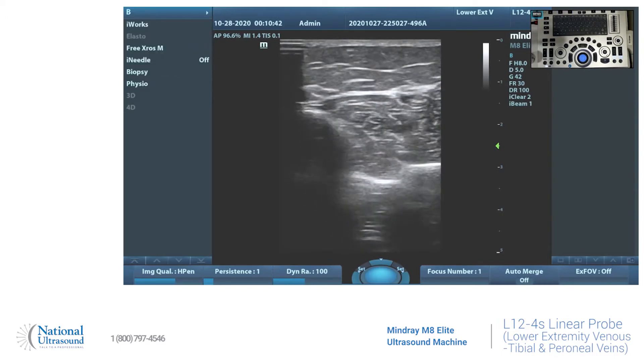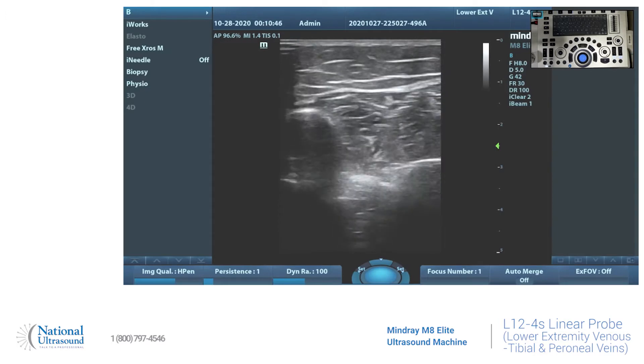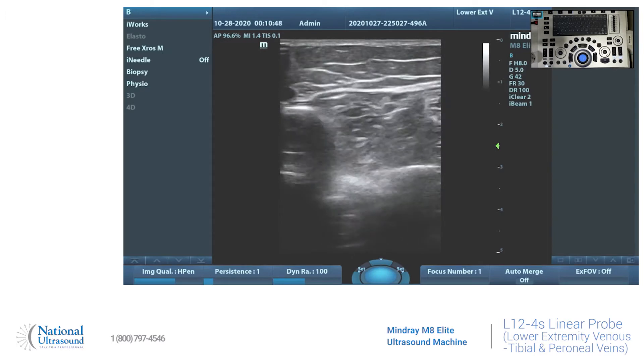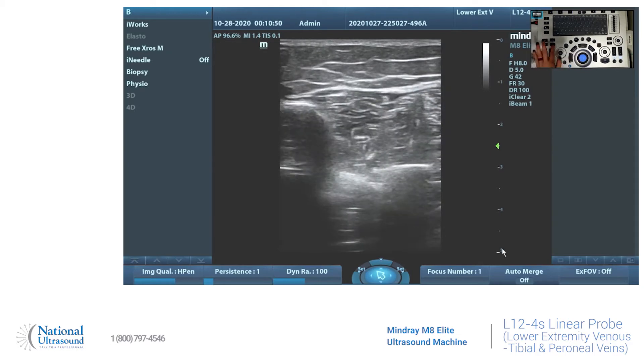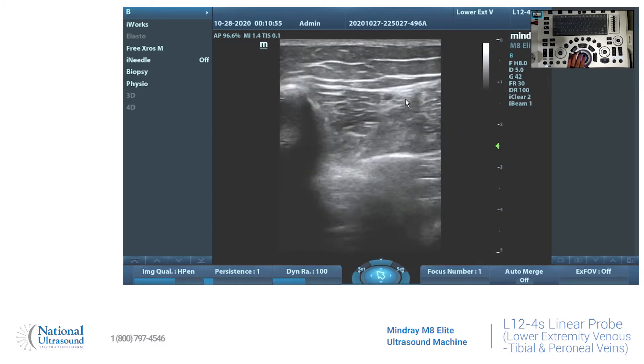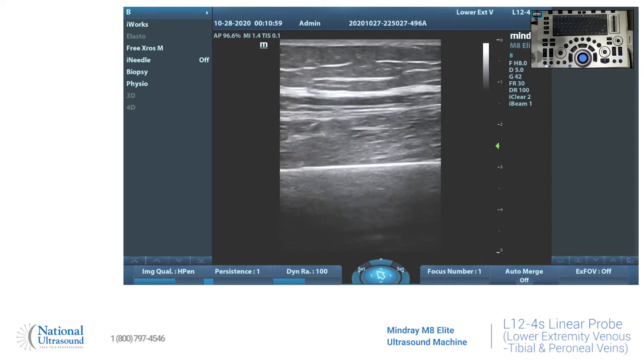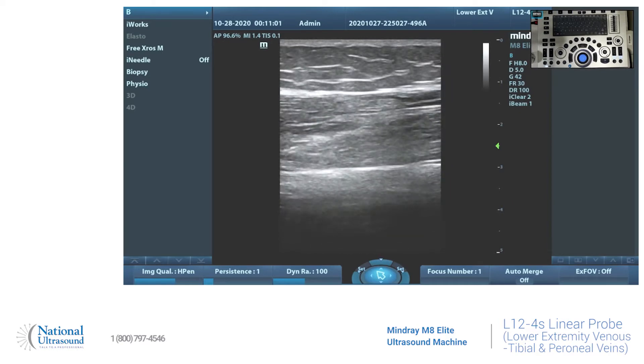We'll be looking at the posterior tibial veins and also the peroneal veins. So we have the posterior tibial at the front — I'll show you with the cursor. You have one artery and two veins, and when you compress it, the veins compress. In long, we're just going to put some color on it and also do a Doppler.